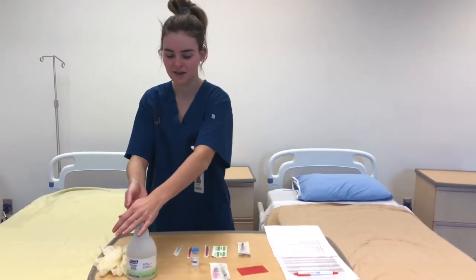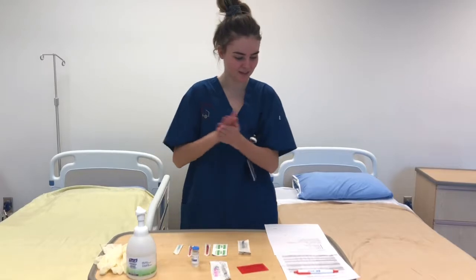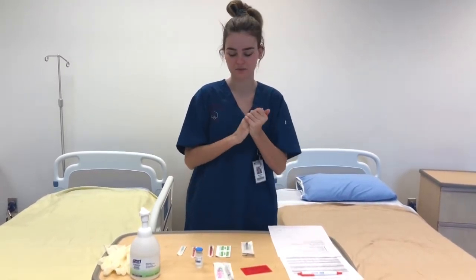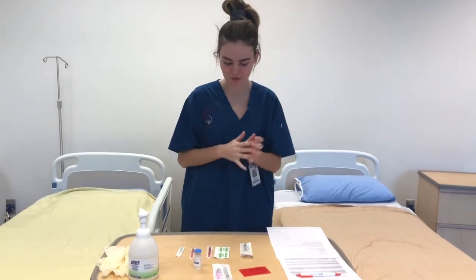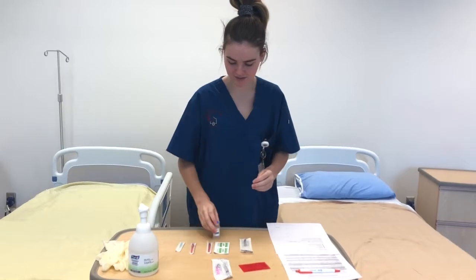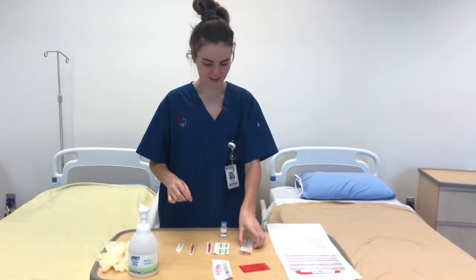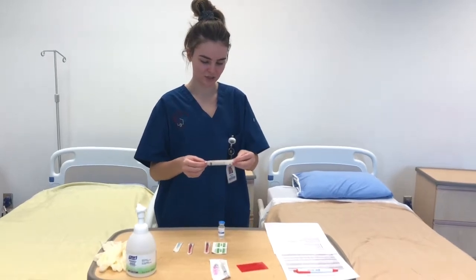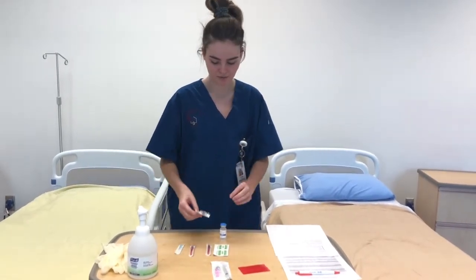So I'm going to wash my hands here with some hand sanitizer, and we're going to assemble the needle and syringe for a subcutaneous injection. This is the syringe we're going to be using, a 3 milliliter syringe.